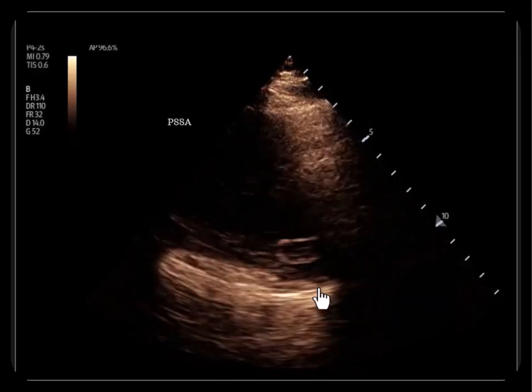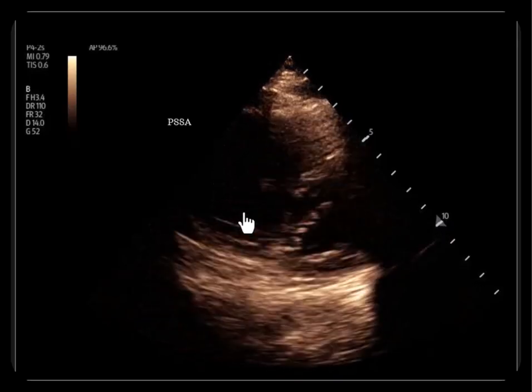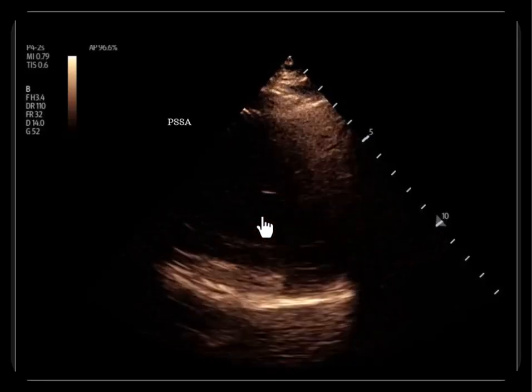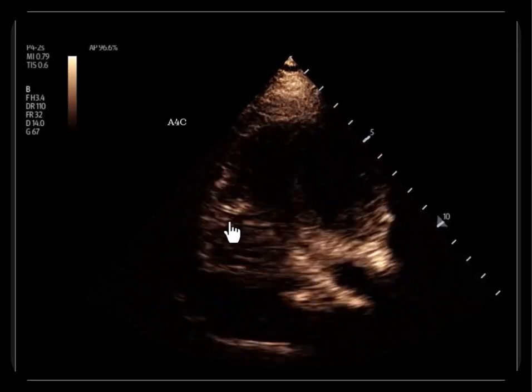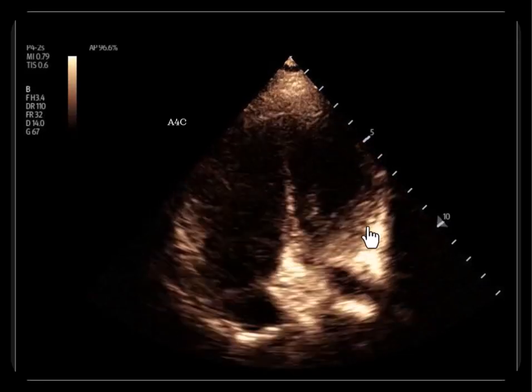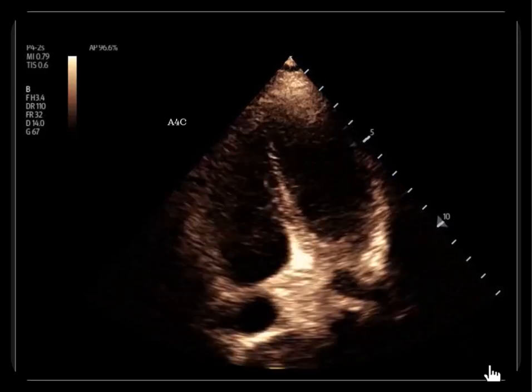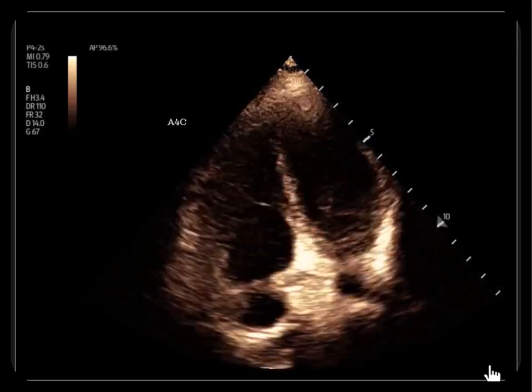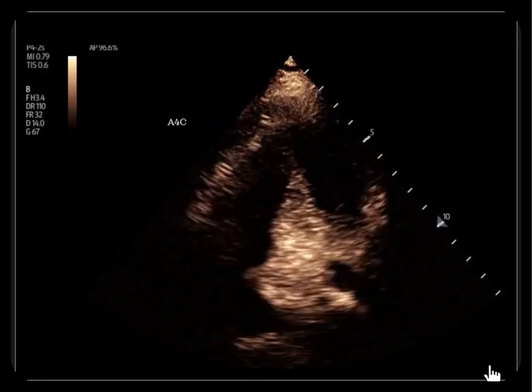On your parasternal short axis window, again, you observe a dilated right ventricle and perhaps some flattening that's starting to take place of the interventricular septum. In the apical four-chamber window, the width of the RV appears larger compared to the width of the LV. Now, this is a real-life case. These aren't textbook images. This is what you can expect to see clinically in an unstable patient. They're not picture perfect, but I want you to see real clinical cases.